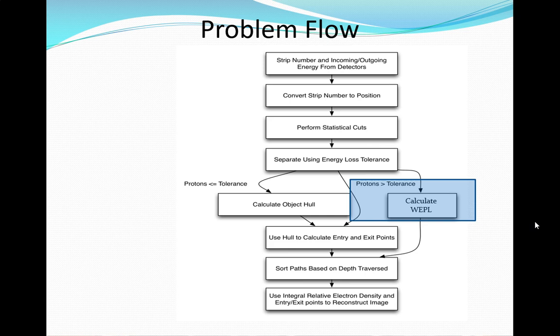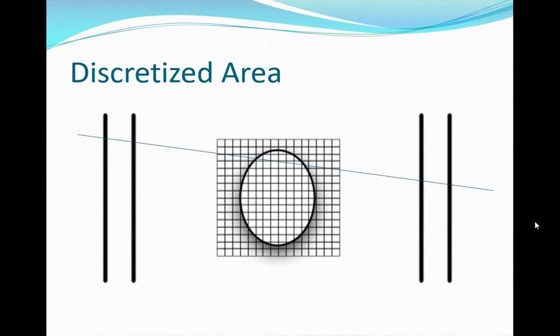Bigger stuff. How do we actually calculate the level? Along with this, this is how you set up the basic problem. Okay, so imagine I take those two vertical lines, left and right. Those are the detectors. Imagine the X and the Y, or technically to us it's T and V, because X and Y don't rotate, that's the room. T and V is the rotating one, based on how the beam is traveling.